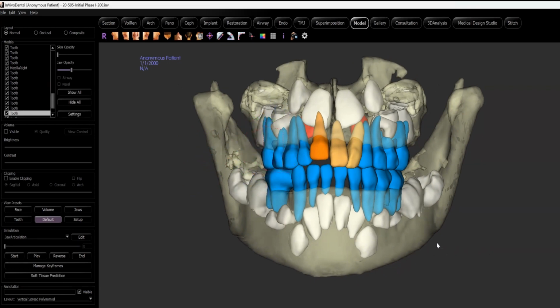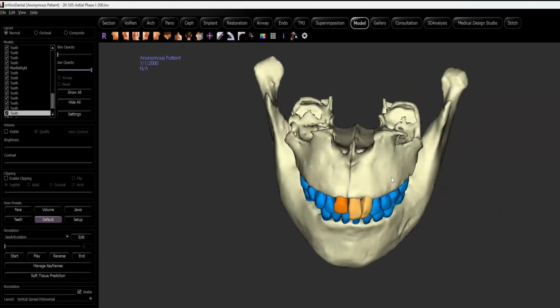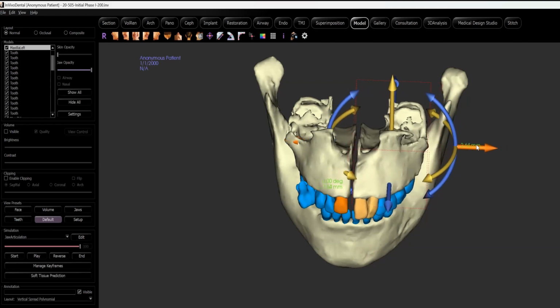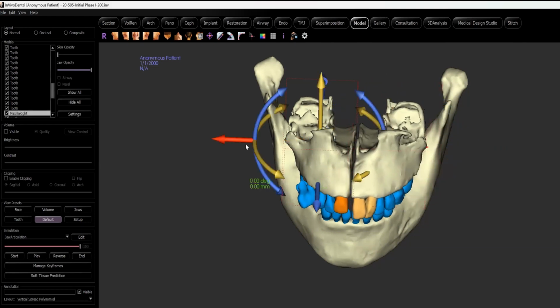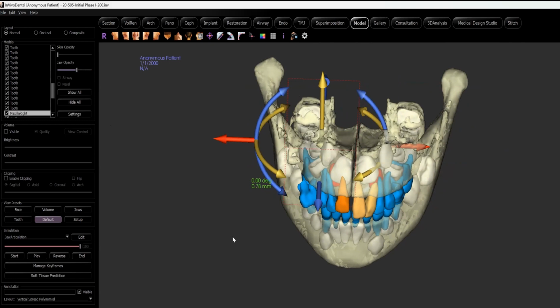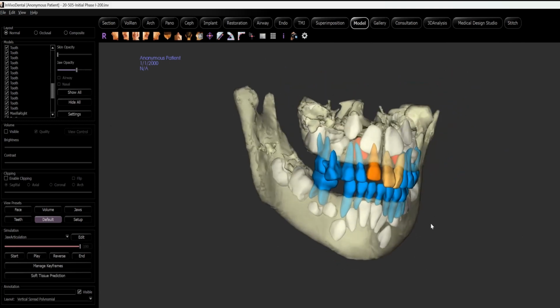So not just are there dental functional movements which are allowed, but skeletal as well. For instance, for rapid palatal expansion on children or on adults using more surgical interventions, we can simulate these skeletal movements. The in vivo model is formed on the premise of the parent-child concept. So the parent is the bone, the jaw, and the teeth are the child or the children.